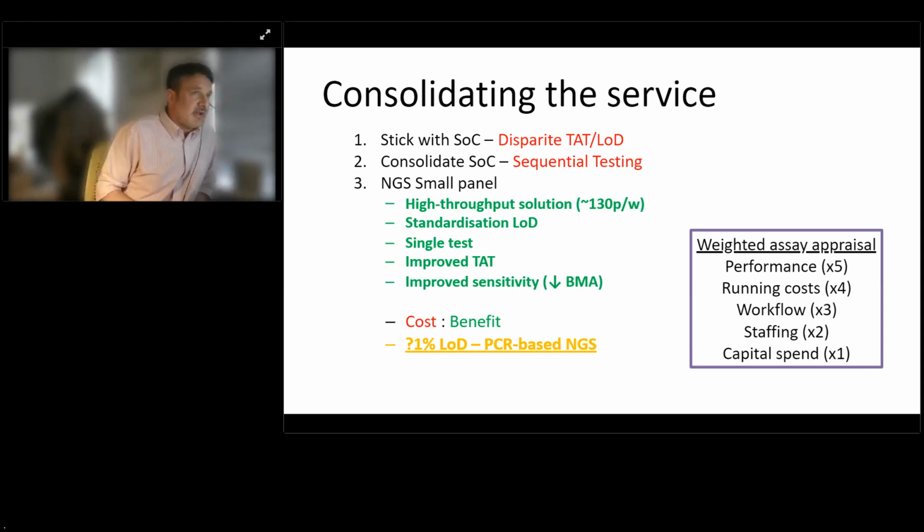In order to consolidate the service, we considered that we would stick with our standard of care test, but that's got the problems I've already described. We did also consider consolidating to a single site with the sequential testing still in place, but that still has the problem of the different turnaround times.